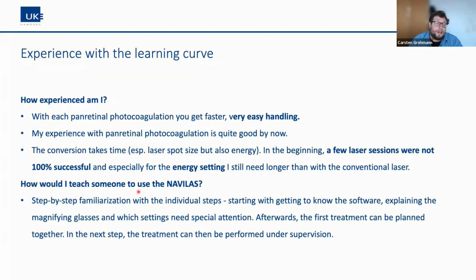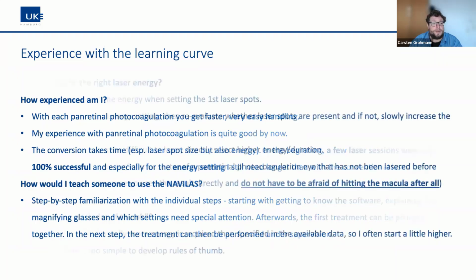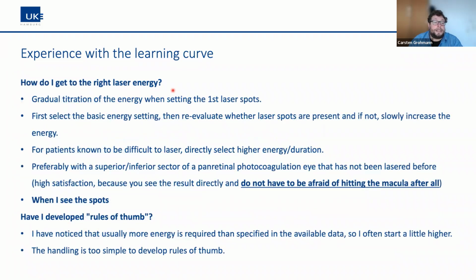How would I teach someone to use the Navilas? Step by step with the individual steps, starting with getting to know the software. Explaining the magnification glasses needs special attention, and that can be planned together. And the next step, the treatment can be performed under supervision. Yes, of course.